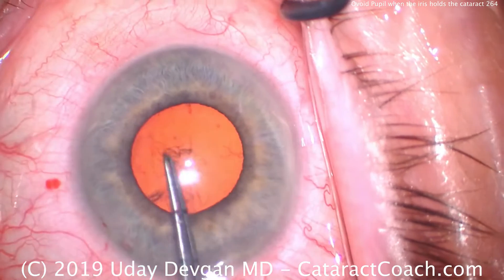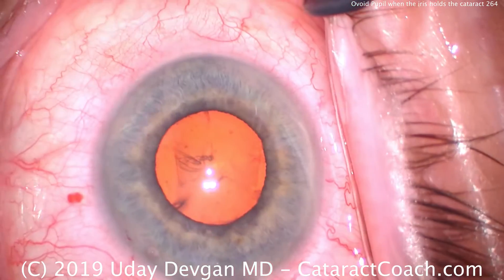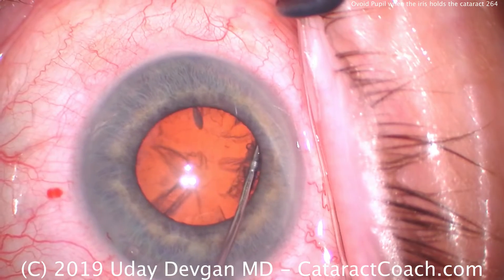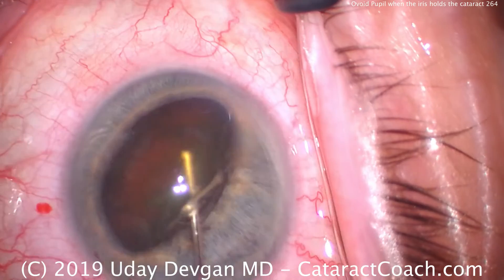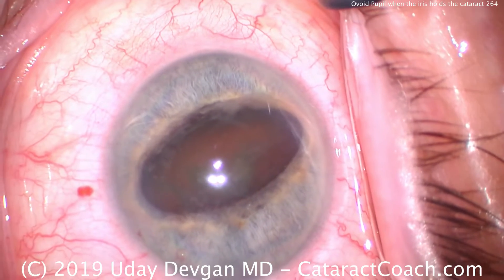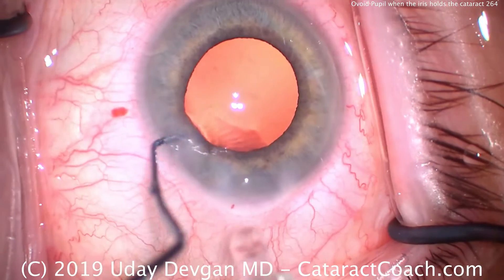With a tiny rhexis you're not going to be able to get the nucleus out of the capsular bag — you must have at least a five millimeter rhexis. So slow and steady, here we go again with the same technique. You wait to see a fluid wave, there it is, and again another fluid wave, and slowly it comes out of the bag. The key is when you get the hydrodissection going, don't stop after you see the first or second fluid wave — keep going slow and steady, no force needed.